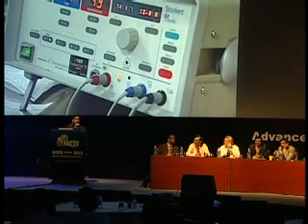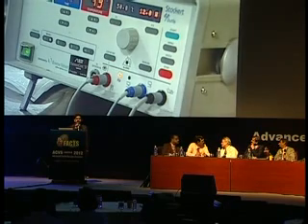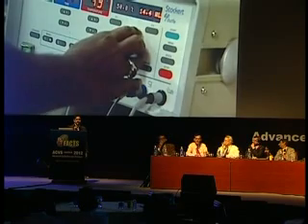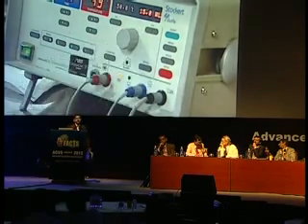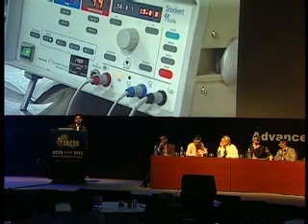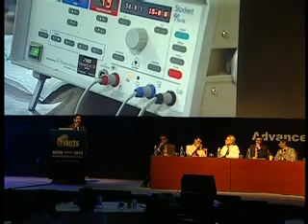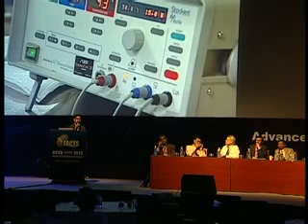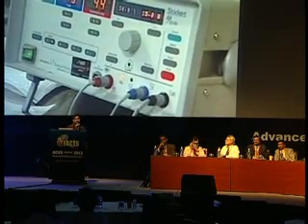Basically, just for the sake of everybody, the monitors are showing the parameters: you can adjust the wattage, you can adjust the time duration in which it can be delivered, and whenever you have a loss of contact, the impedance changes. That's how we decide. All this needs to be particularly monitored with this system, unlike the RD and Medtronic systems which have inbuilt mechanisms to auto cut off if there is a change. Here also it gets cut off, but you need to fix it ourselves. It's not everything is done.